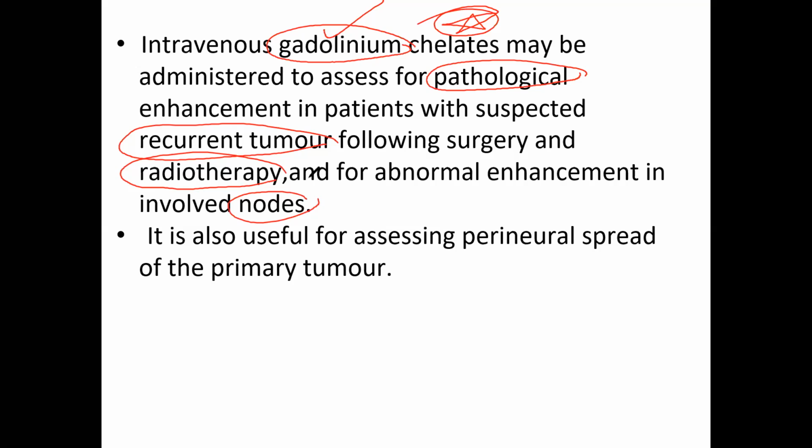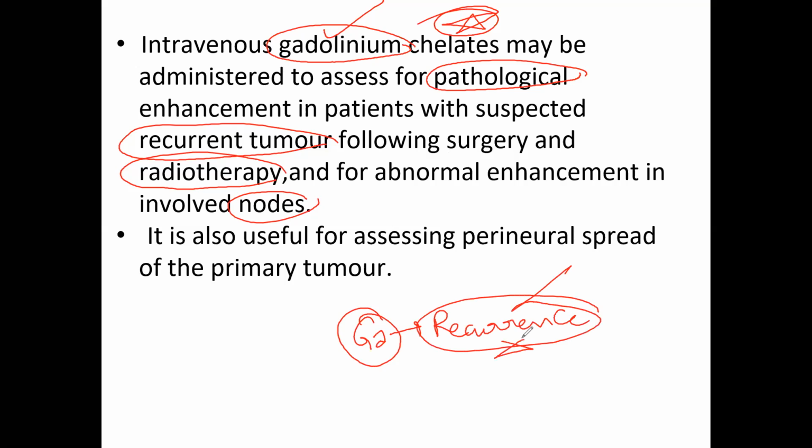So you should think that gadolinium is very useful for recurrence. Keep in mind the recurrence, and also the radiotherapy and the nodes, as we have seen already.